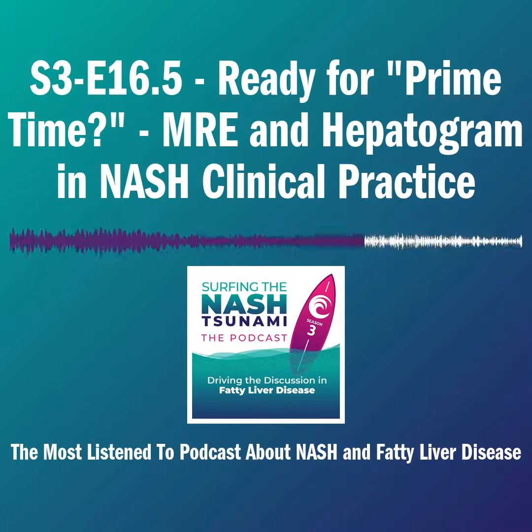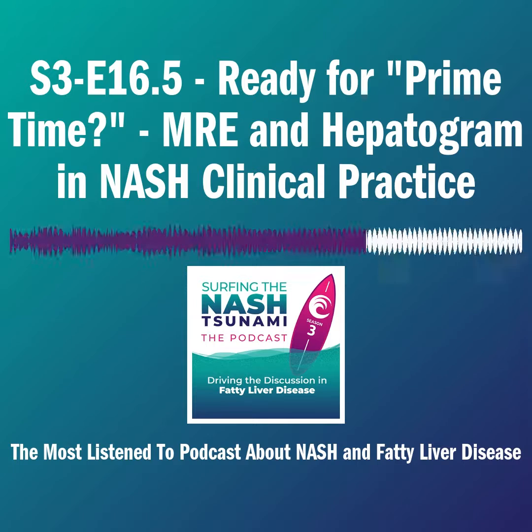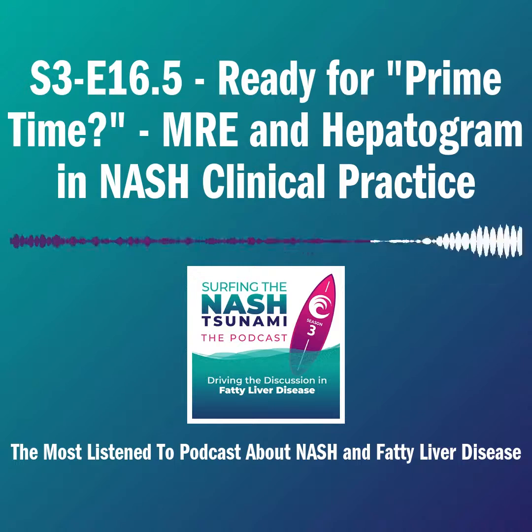Can I just ask, the FDA at NASH-TAG were fairly keen on more data in comparison to biopsy. Is there any data looking at a biopsy, AI read, and then MRE, and which one is picking up the changes in the liver more accurately? Because by the sound of all of the trials that you've referenced, we must have enough biopsies to look at where the changes are, how AI is interpreting the biopsy, and how AI interprets it to MRE. Because if we can establish that MRE and AI are a far better predictor than liver biopsy, is that the type of data that gets us to beyond the biopsy?